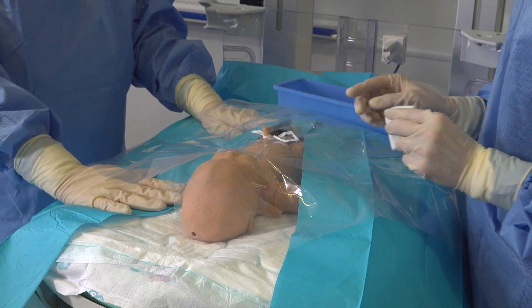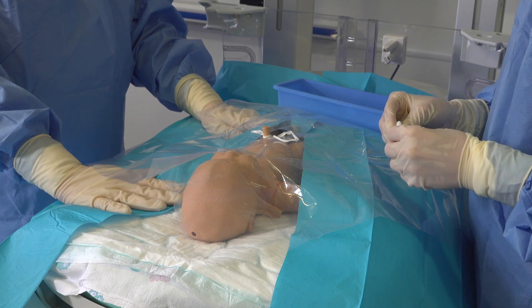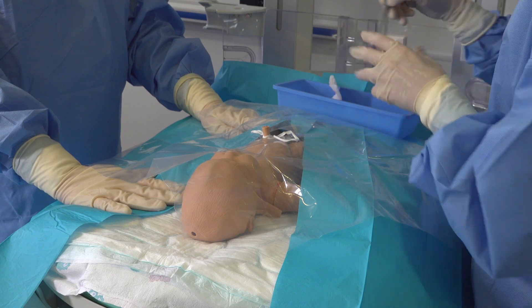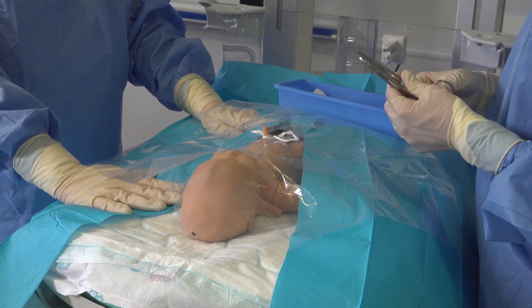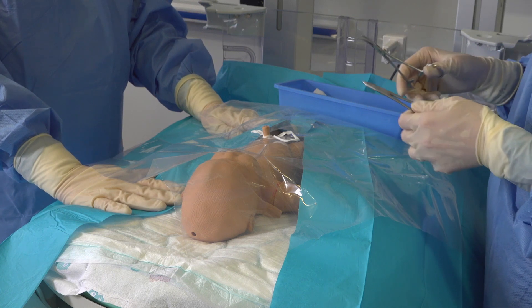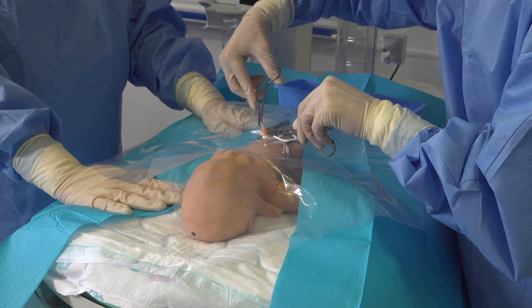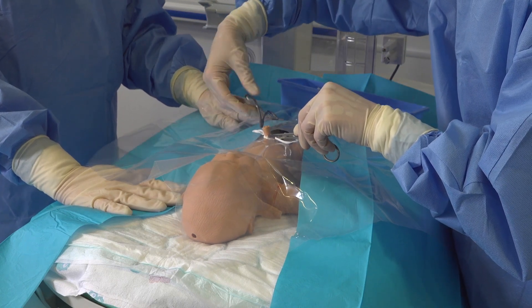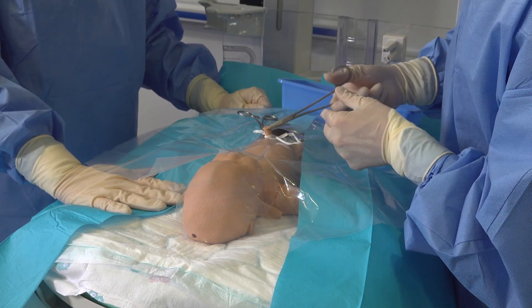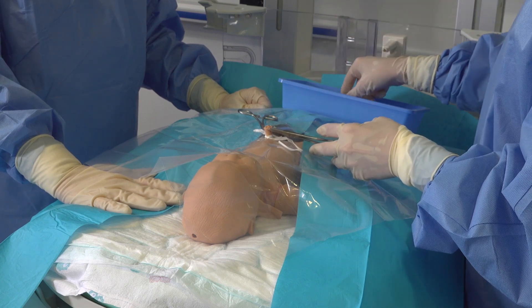With your sterile gauze clean away any additional blood that has perhaps oozed from the cord, prior to locating your artery that you plan to insert your line into. Whenever you have somebody to help you, they can help you hold your cord in a good position and this sometimes helps to make your arteries a little bit easier to insert your UAC into.